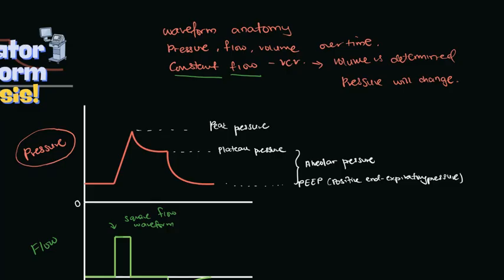This alveolar pressure will indirectly give you an idea of the compliance of the lung. If the plateau pressure is high, meaning that higher pressure is needed to expand the lung, it tells you that the lung is stiff. A very important detail that needs to be highlighted is that plateau pressure is unrelated to flow. It is purely the pressure in the lungs from insufflation with a controlled volume that we have preset.